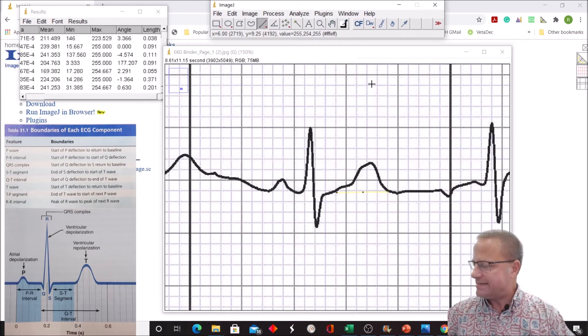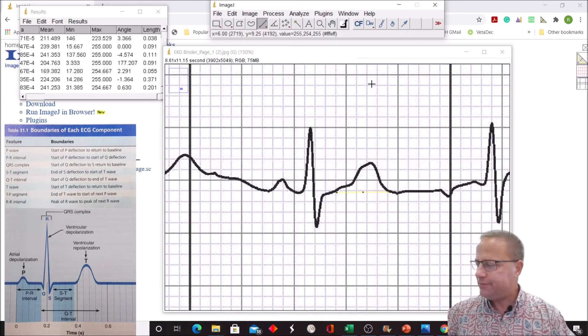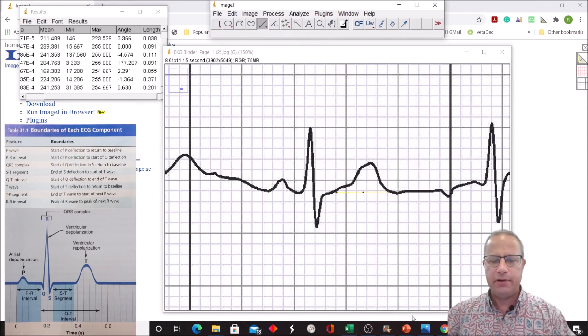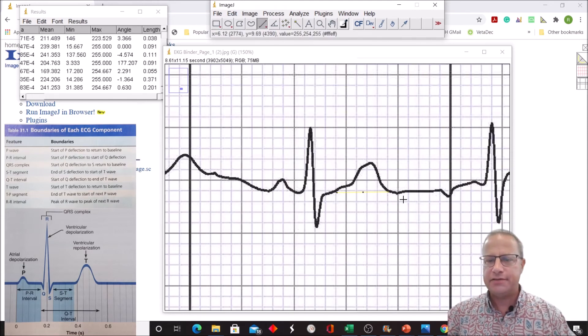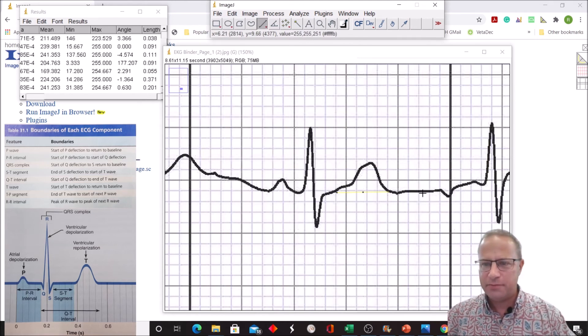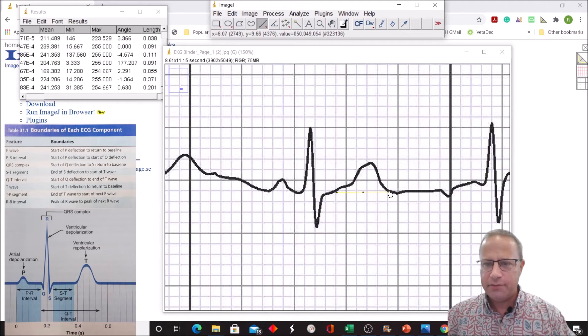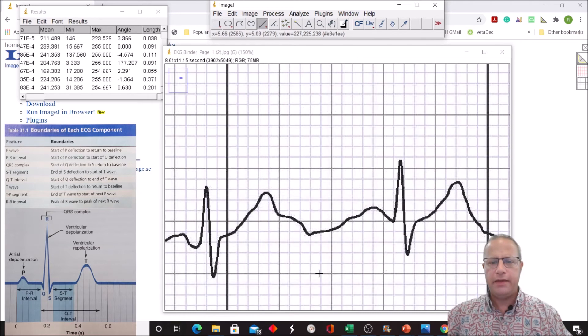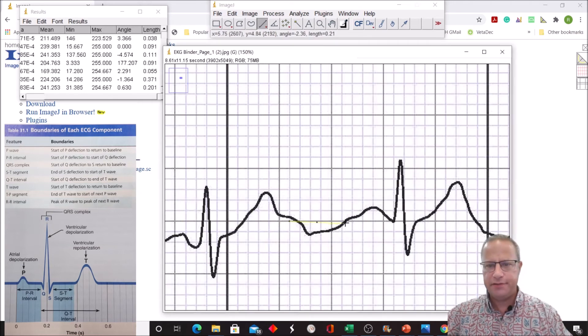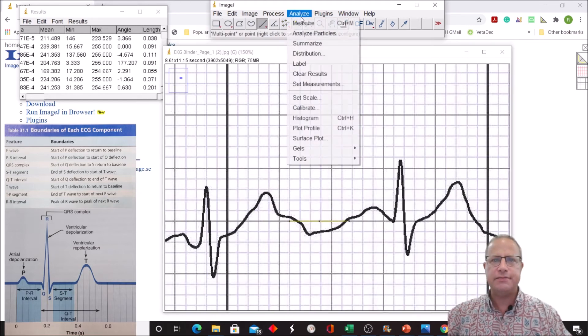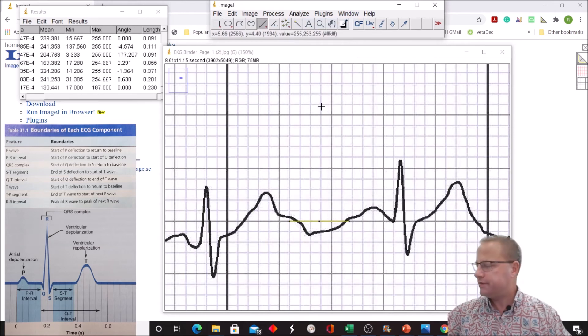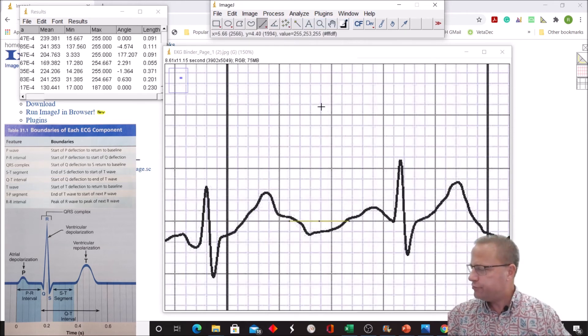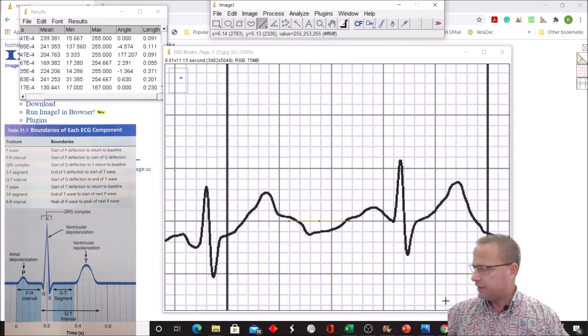Next we're looking at something called the T-P segment, end of T-wave to the start of the next P. It does not contain a wave in there, so end of T to start of next P. This P-wave here is kind of uncertain, so let's take a look. We could go to a different pattern, but if I want to measure off this one, here's one. It's not great, but we can say this is the end of T-wave to the start of the next P-wave, maybe right about there. Analyze, measure, we get a distance of 0.23 seconds. That can be somewhat variable.